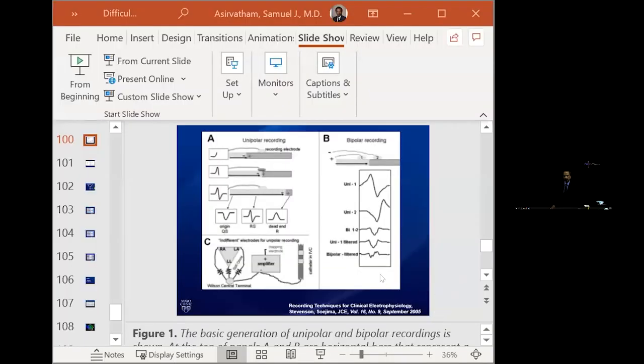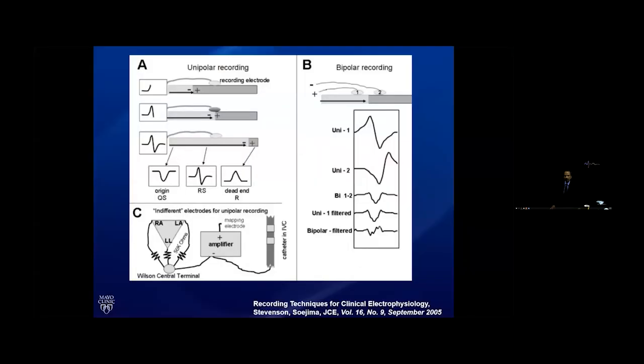Great. So maybe we can go through each of those in detail. That's a very nice detailed discussion about multiple uses for unipolar recordings. Just to get everybody on the same page, there is really no true unipolar recording. It's always a bipole. It's just that the indifferent electrode is something very far away, or it's guaranteed that you don't have any signal from there.